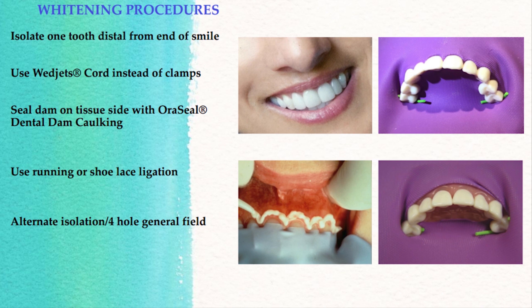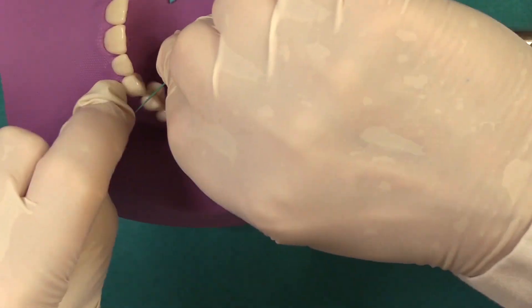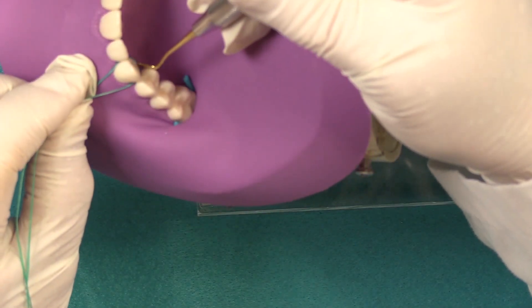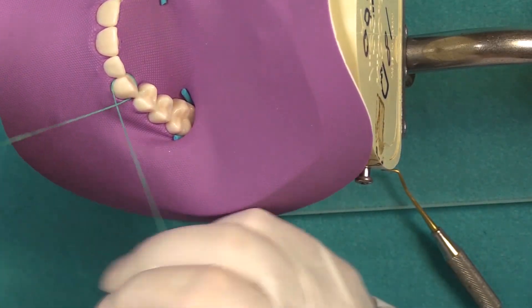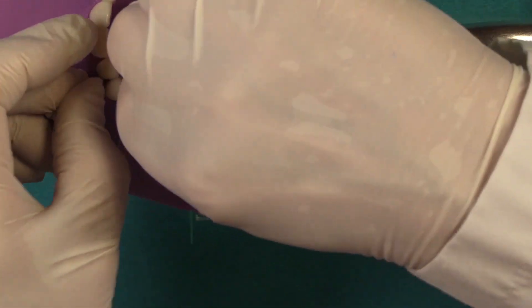You want to make sure that your dam is properly inverted. See that canine here is not really very well inverted. So you want to go back in here using your dental floss and invert it — cross it to get that to invert.